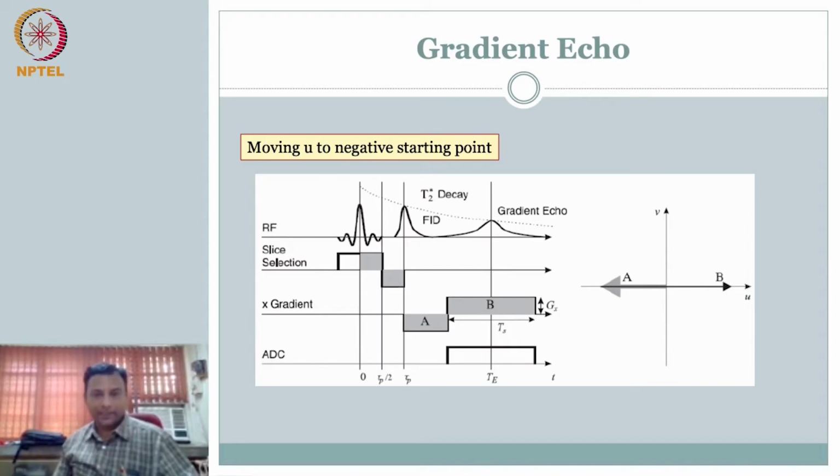What is still pending is how do you move along the v direction. In other words, we did z gradient, we have used x gradient. So we need to separate it out in the y direction, which transfers to the v direction here. How do we do that?